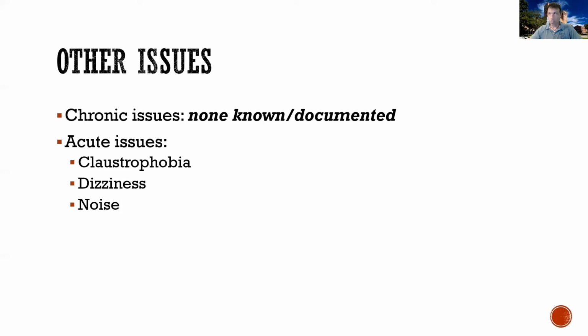Finally, actually, one to last, noise is also an issue. And now I've never played that for you, but the MRI machine makes a lot of noises. In fact, different acquisition types will make very typical noises. And it tends to be pretty loud. And this has to do with the gradients switching rapidly, typically. So the MRI machine can be very loud, and for this reason, we always provide our participants little earplugs that they have to wear when they go inside the MRI machine.